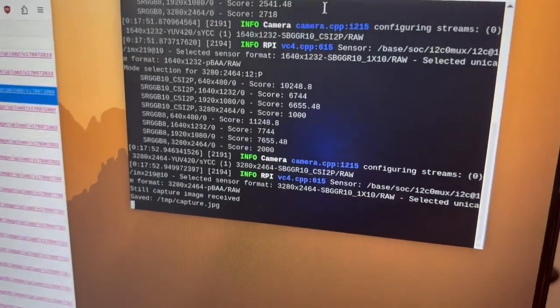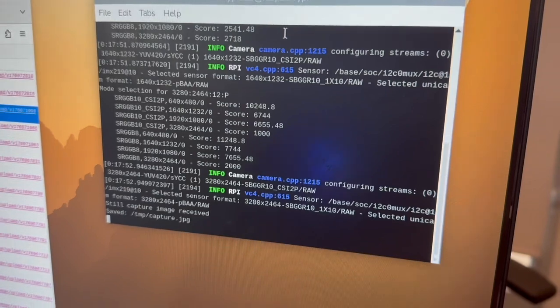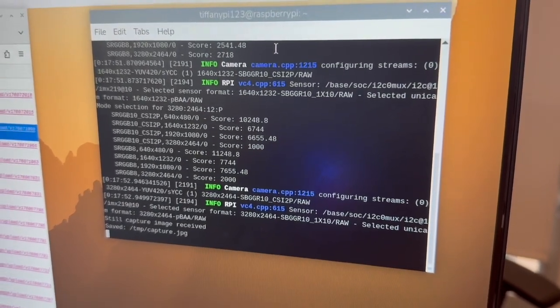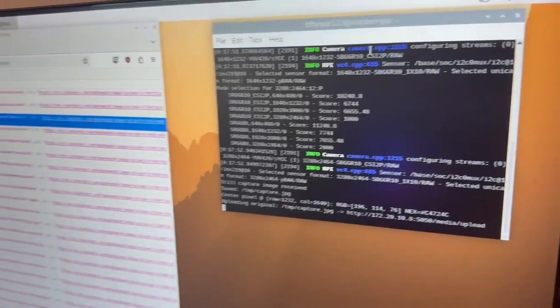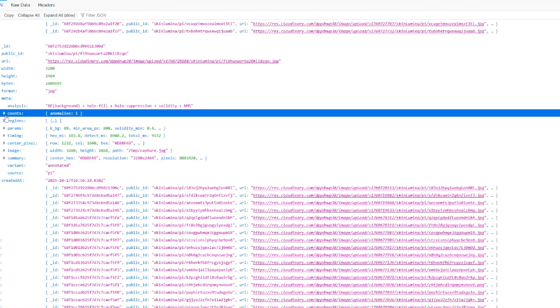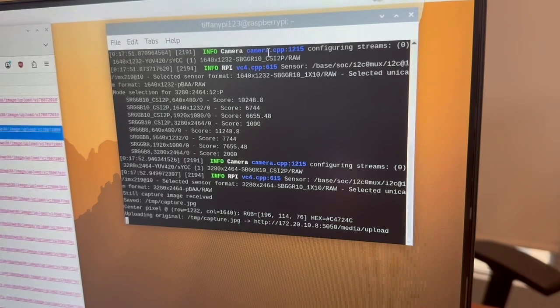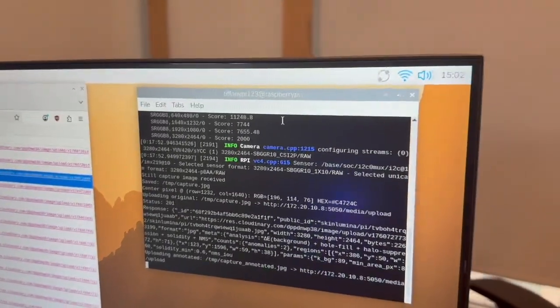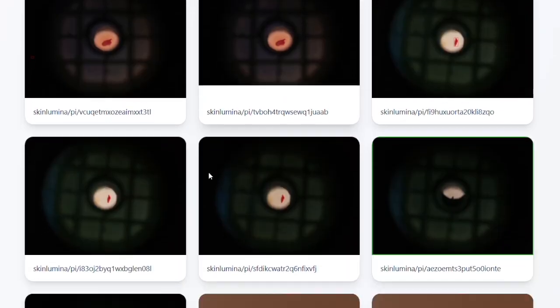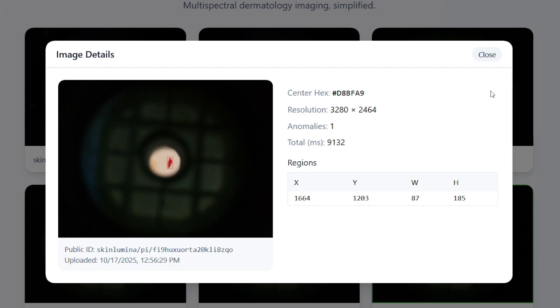The Pi posts the original and annotated images to the Node Express API, which uploads the files to Cloudinary and saves the metadata in MongoDB. Here we can see the image being uploaded to our full stack website. Metadata is stored in JSON fields which contain information such as the hex code, image processing time, resolution, and detected regions. Express and Node use an in-memory multer to stream the buffer into the Cloudinary SDK. On success, we get a public ID and secure URL pointing to the image in Cloudinary. The React client fetches the image and renders UI cards that have each image uploaded with its respective metadata and an image annotated with its potential abnormality detected.